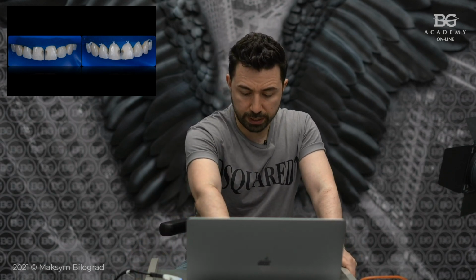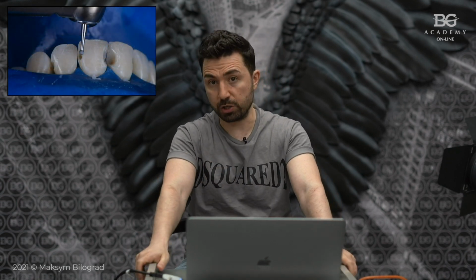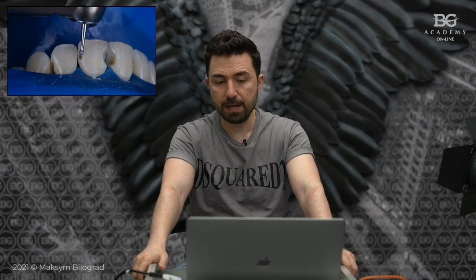So the next is, after that kind of tricks that we know, we can go for preparation for refining of the margins. And actually that is a very important step, because if you do not treat enamel properly, the peripheral enamel around your defect, you may get some optical differences between the artificial part and your natural tooth part, like a gray line, white line, or whatever.